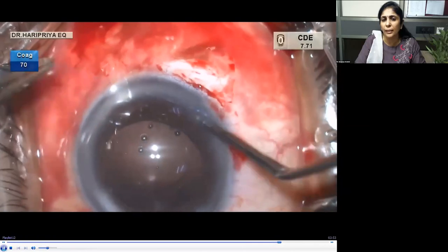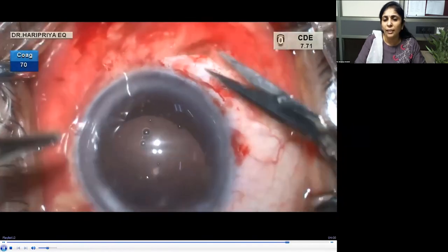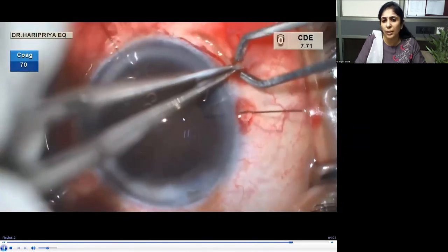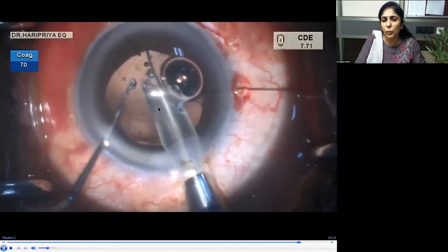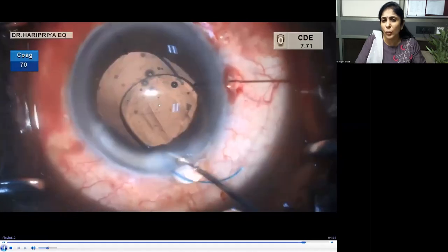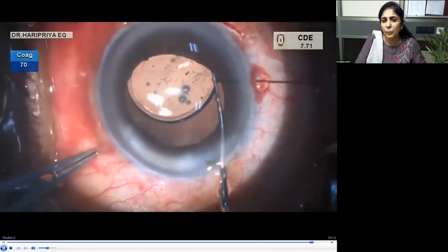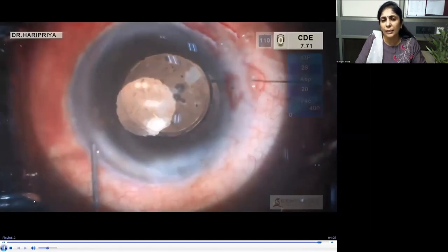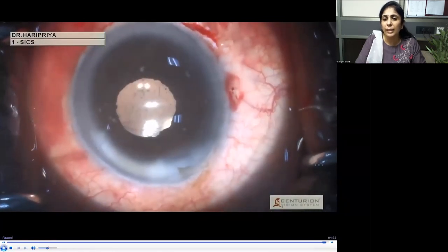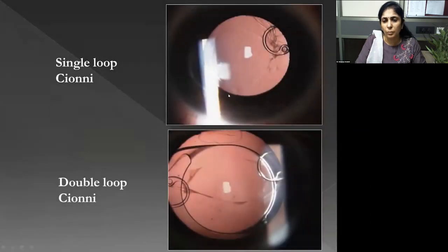Once that is done, the two ends are tied together — about five or six knots will secure the bag. Keep an eye on the bag to make sure you don't pull it too close to the fixation site, but aim for a central rhexis position. The hooks are removed when centering, then replaced before IOL implantation. A three-piece IOL is placed in the bag because, despite the Cionni ring, IOL decentration may occur later, and a three-piece is easier to fixate to the iris or sclera if needed.